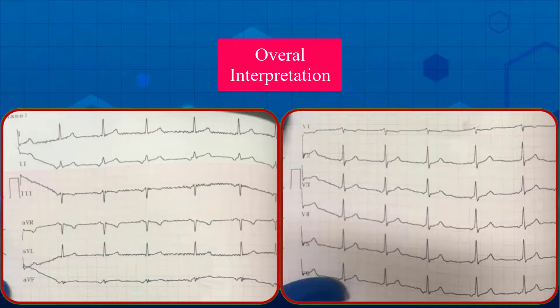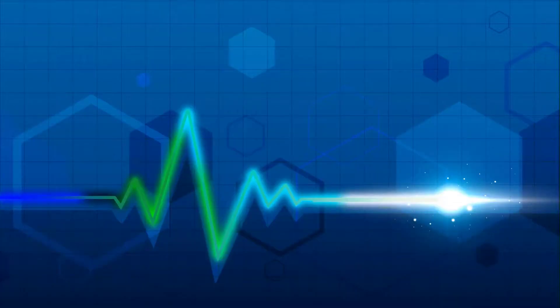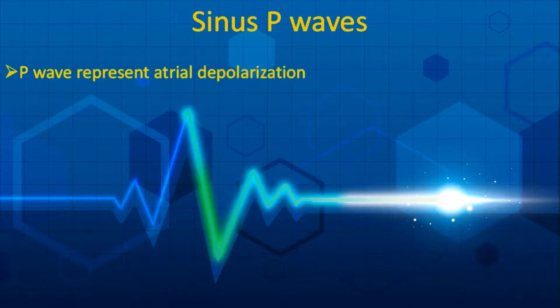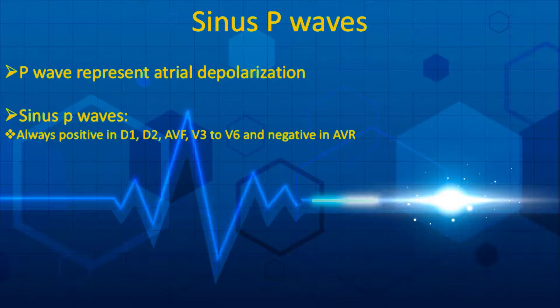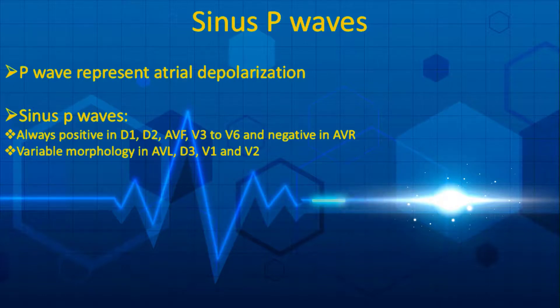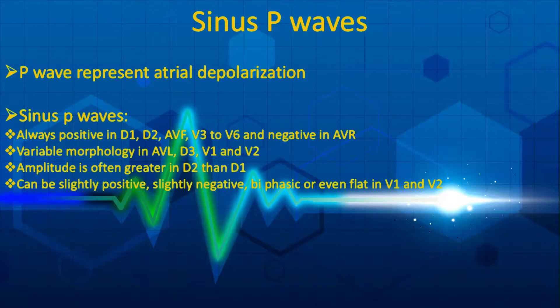To interpret every EKG strip properly, make a list of abnormal findings. In this strip, the abnormal finding is ectopic atrial rhythm. The hallmark of every ectopic atrial rhythm is the presence of non-sinus P waves. It is essential to know normal variations of sinus P waves. A P wave is the first wave of the electrocardiogram, representing depolarization of the biatrial chamber. Sinus P waves are always positive in D1, D2, AVF, V3 to V6, and negative in AVR. They have variable morphology in AVL, D3, V1, and V2. The amplitude of the sinus P wave is often greater in D2 compared to D1. Sinus P waves can be slightly positive, slightly negative, biphasic, or even flat in V1 and V2.